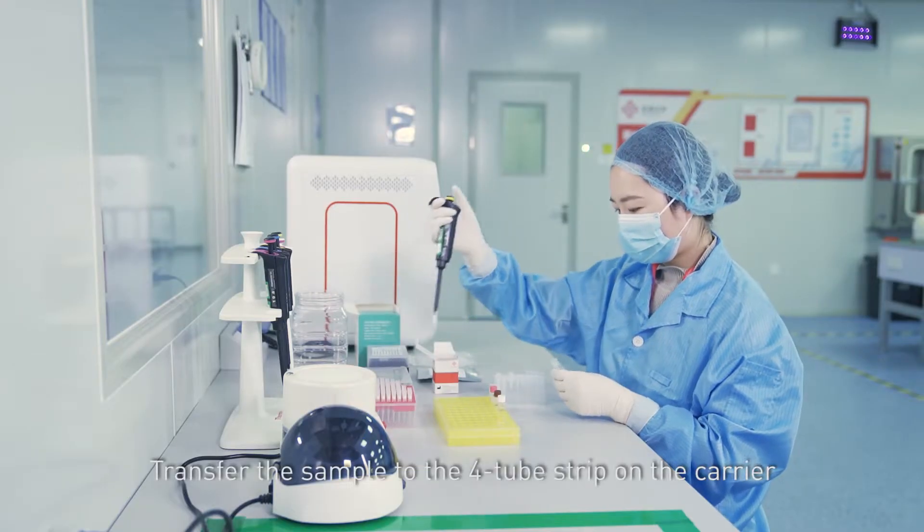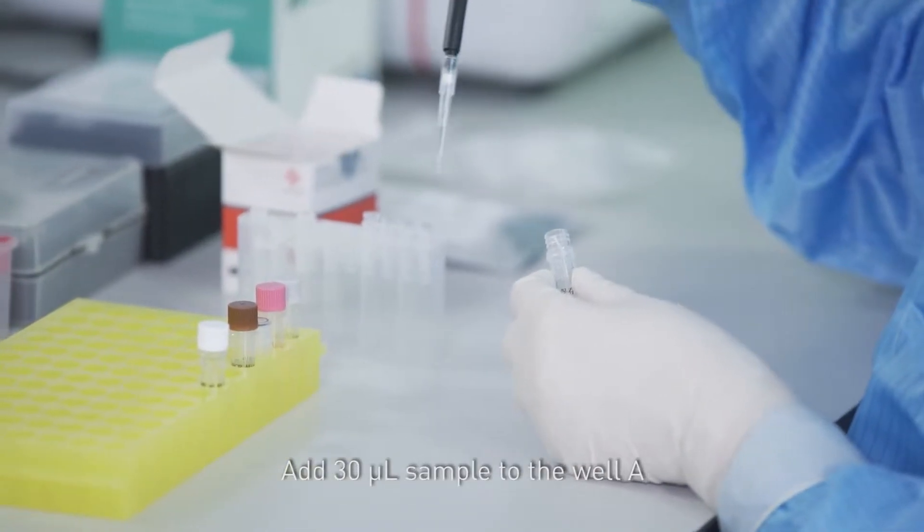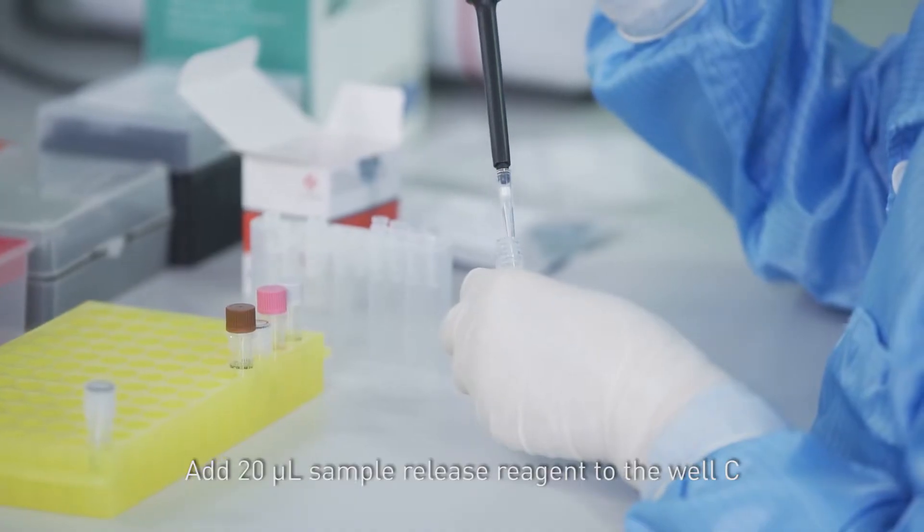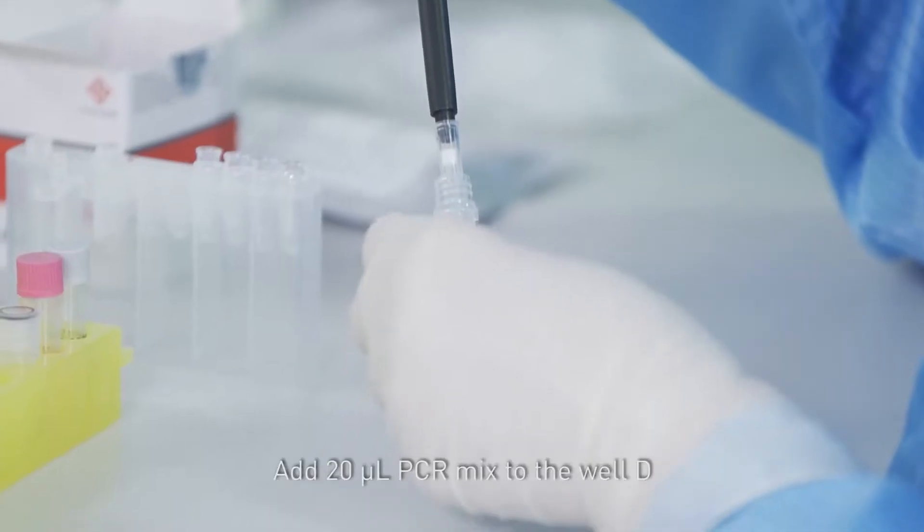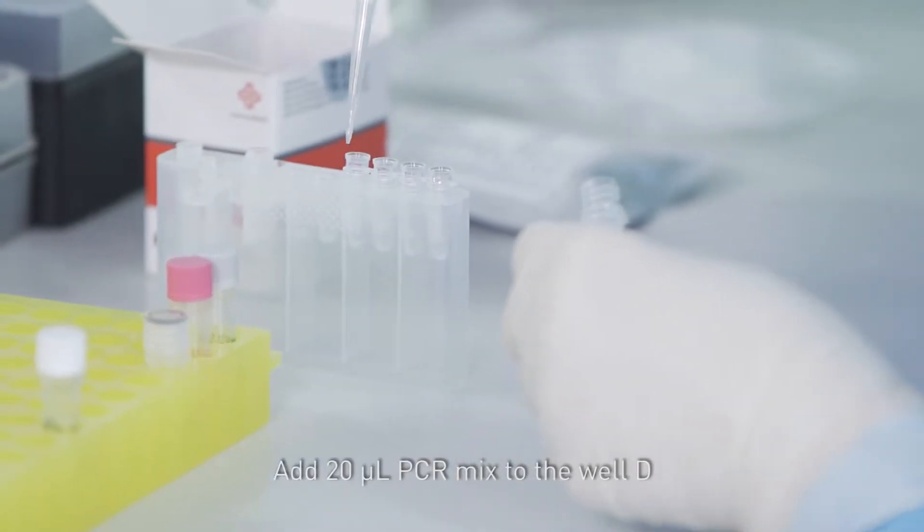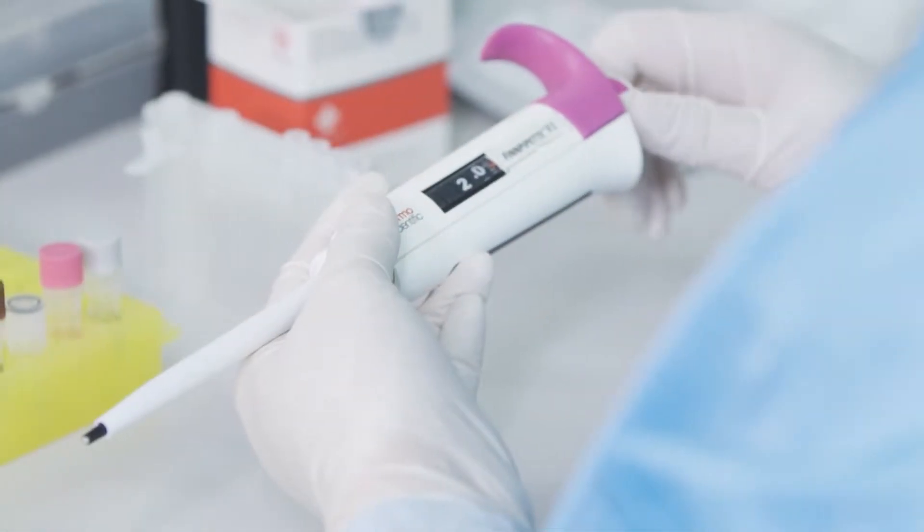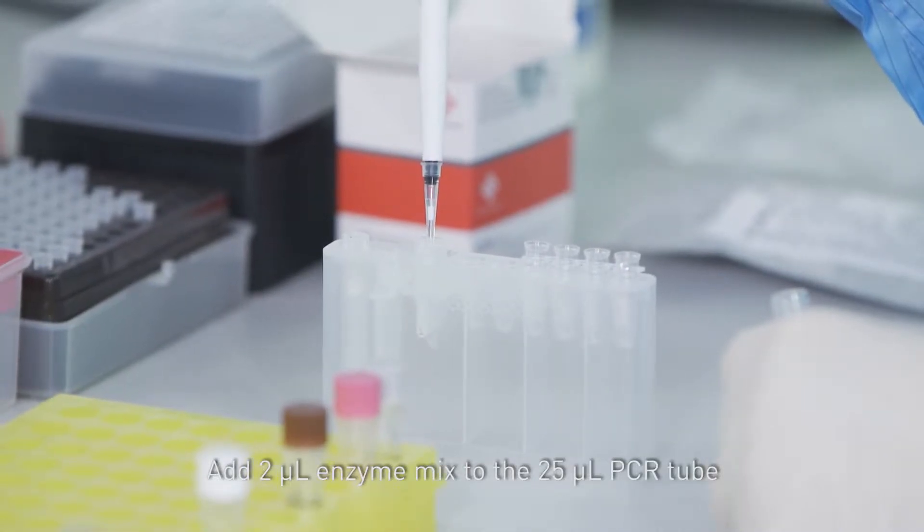Transfer the sample to the 4-tube strip on the carrier. Add 13 µL sample to well A. Add 20 µL sample release reagent to well C. Add 20 µL PCR mix to well D. Add 2 µL enzyme mix to the 25 µL PCR tube.